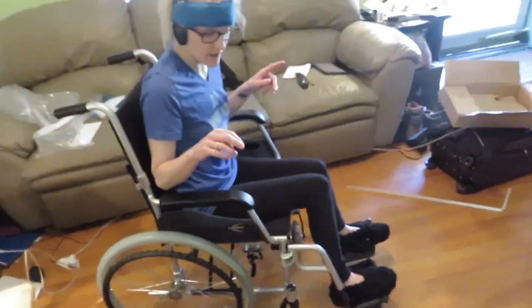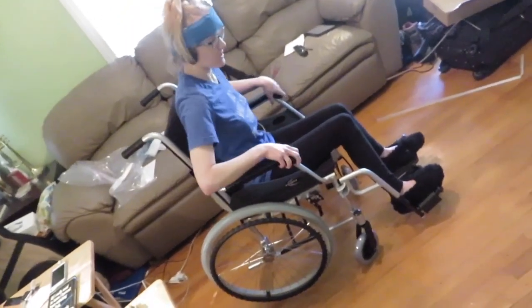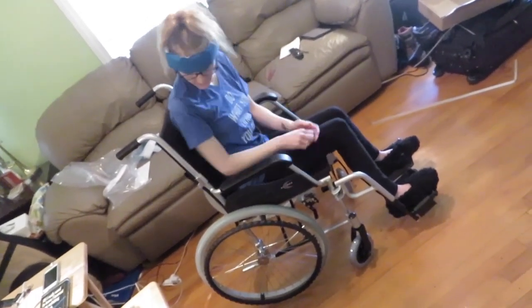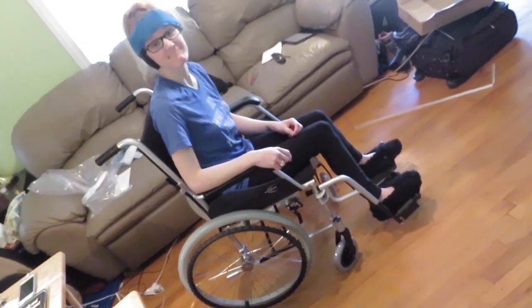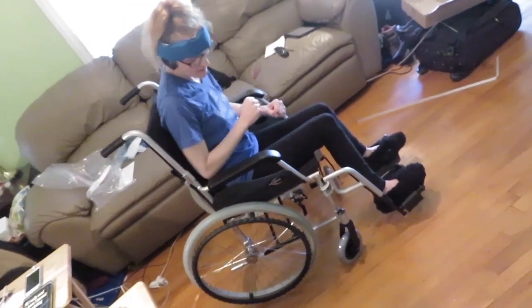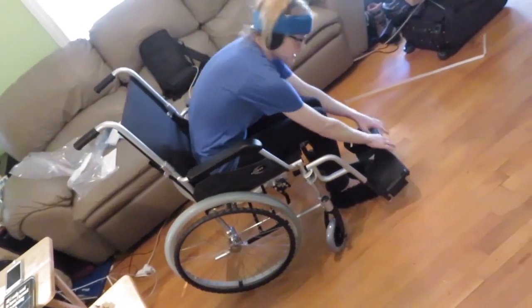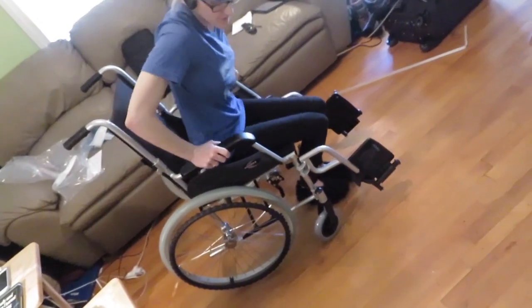The armrests — I got desk-length armrests on purpose so it's easier to slide up to a table. They're not completely desk-length but they look kind of low, which is good too. You can slide into tables pretty easily. One really cool thing about this chair is the footrests — they just slide right up and then swing out and come right off, as you saw us putting them on.